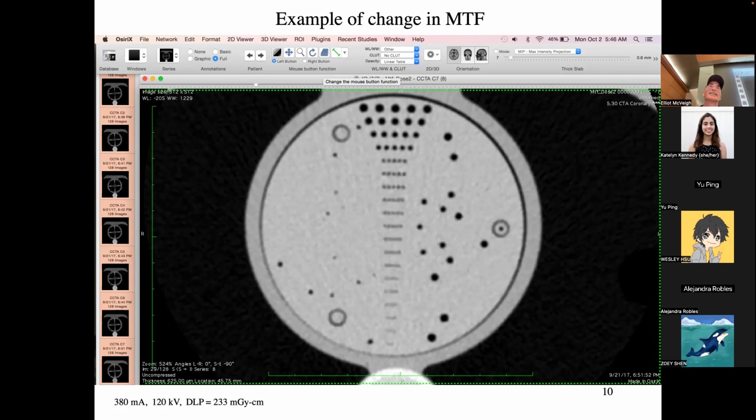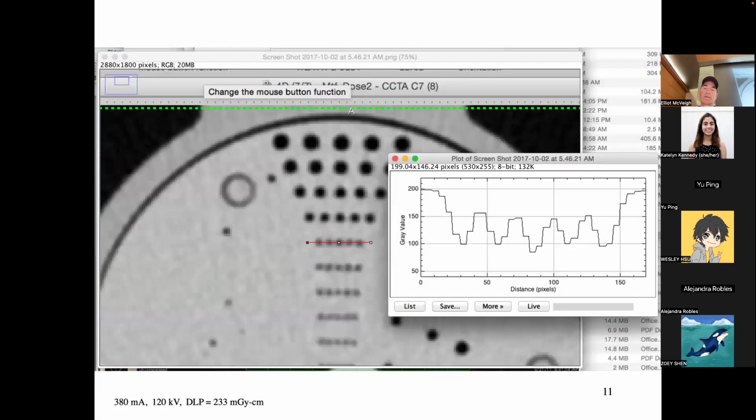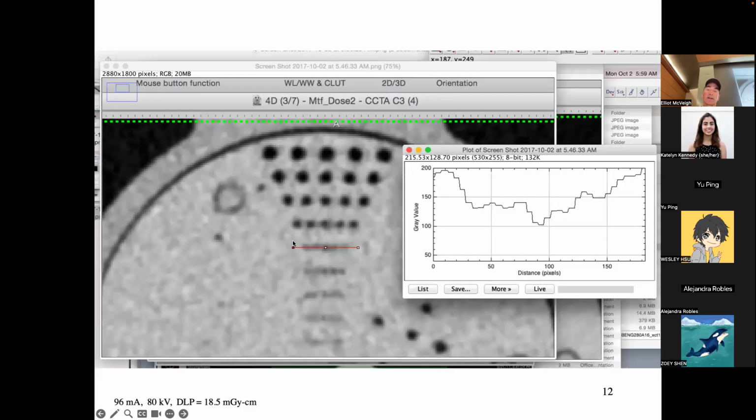They don't tell you what they're doing actually underneath. They just do that. But okay, so you can make these measurements with a phantom, and exactly the way we saw in that theoretical thing up top of the sine waves, if I look at the signal modulation of these small dots and I just plot it, and you'll do this in the homework on ImageJ, I think. So you just draw that and you see, okay, in the background, looks like I have, you know, maybe 200, and then I come down, it goes to 100, then comes back up, almost not all the way, right? It's been diminished somewhat, and then up and down, up and down, up and down, okay? If I look at what happens with that image that had only 100 milliamps or like a fourth of the photons, now my plot looks like this. I still have the same background, but I really can't resolve what the heck's going on in here anymore. It's all blurred together, right?